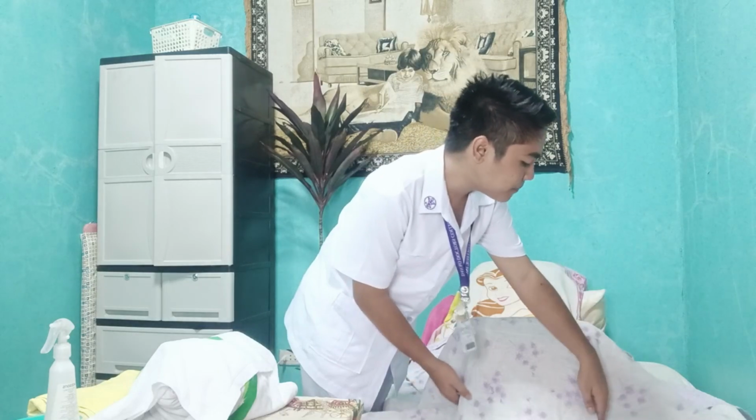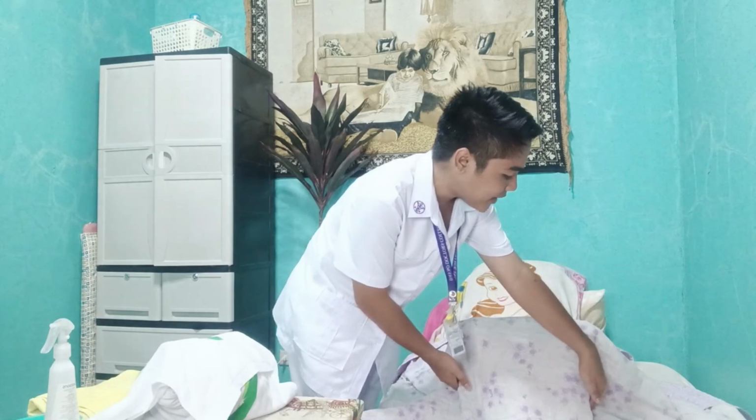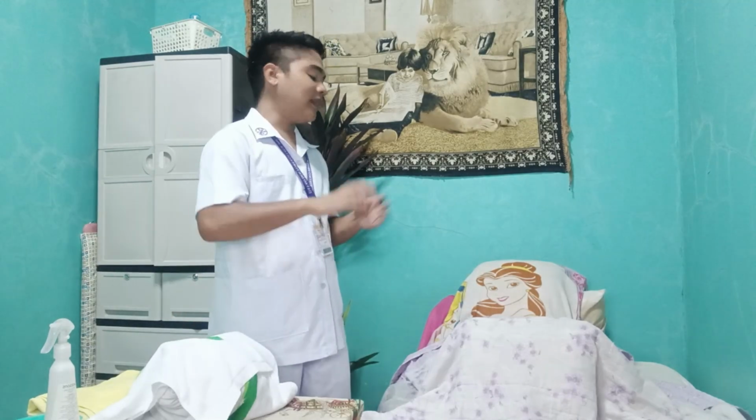Okay, so can you please do a dorsal recumbent position for me, ma'am? Okay, that's great. Next thing that I am going to do is to secure the urinary bag on the patient's bed frame. So the urinary bag should be below the waist level of the patient. Since my catheter is in the packaging, let's set that aside because we will arrange it later and put it all into our sterile set of materials.